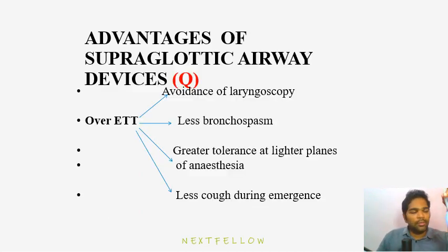Now advantages. Remember, this is a very important MCQ question. This is what I want to tell you in this presentation. Advantages of the supraglottic airway devices over the endotracheal tube. What is the advantage? Avoidance of laryngoscopy. See, for laryngoscopy we use this instrument. You might have seen laryngoscopy during your internship, during your UG days. Laryngoscopy is a painful process.